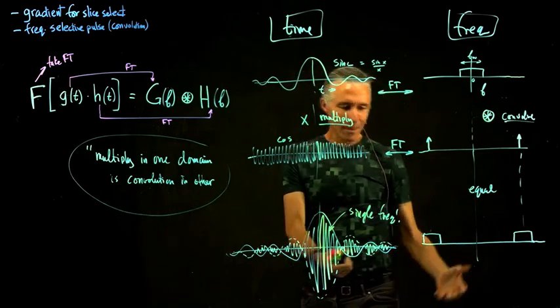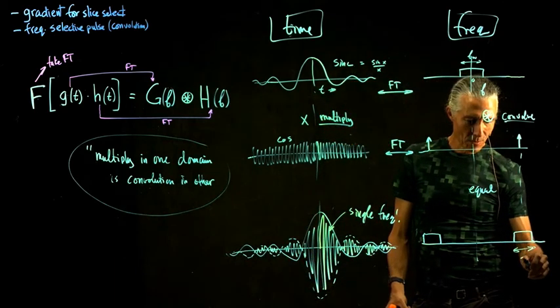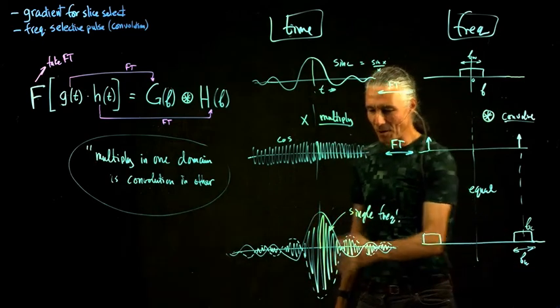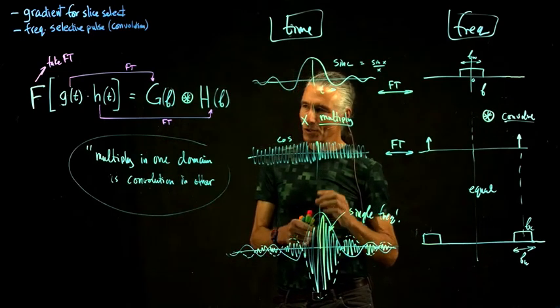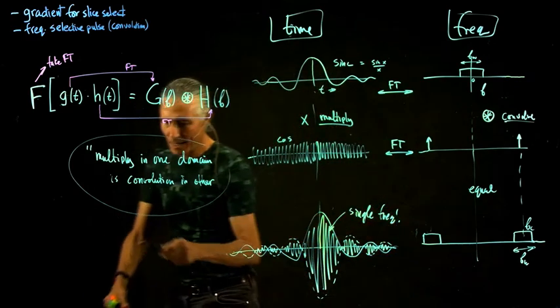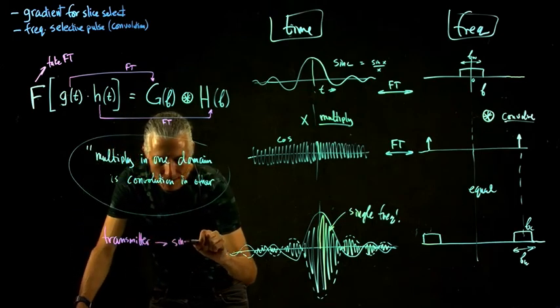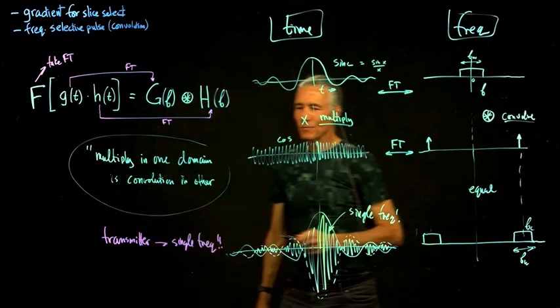But when you Fourier transform it, what do you get? You actually get something that has a frequency width and the center frequency. So now there's the center frequency, this is the frequency width. So amazingly, this thing, what is it? You just turn the envelope of the transmitter on. So how does the transmitter actually work? What does the transmitter do? It just makes a single frequency.